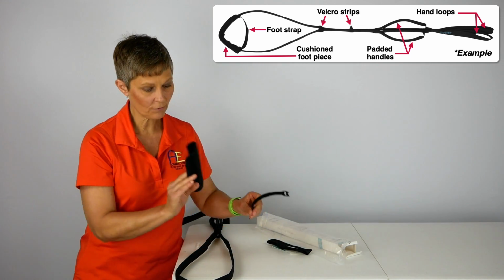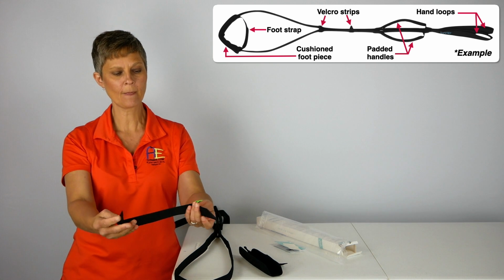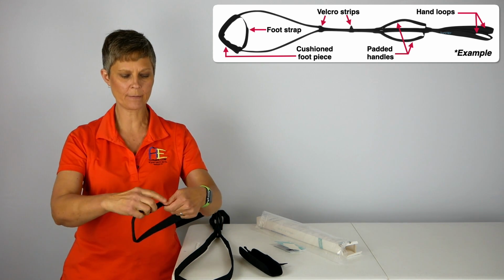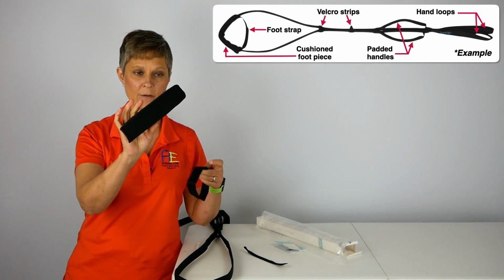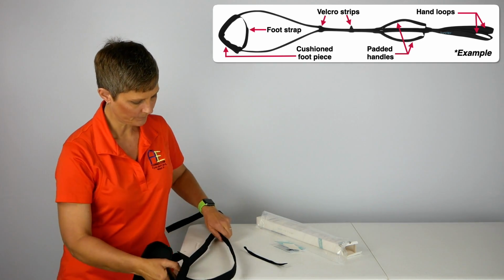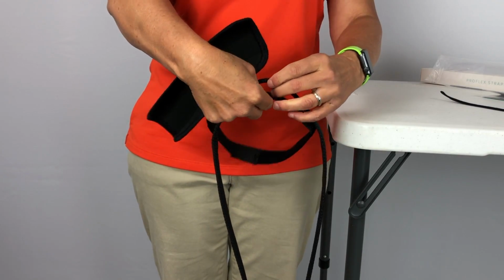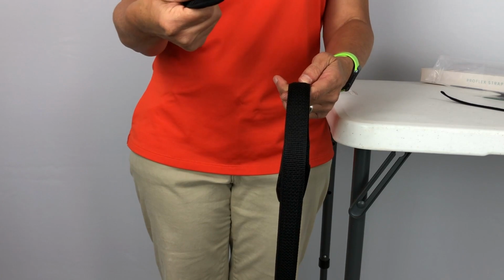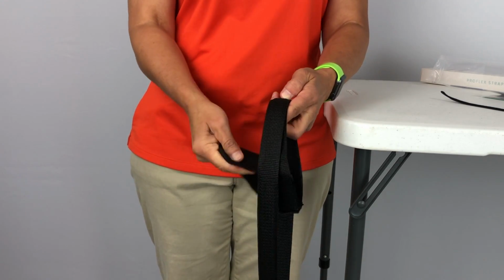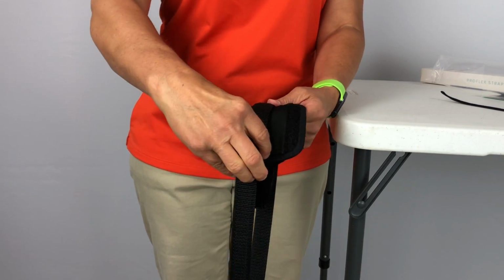So next I'm going to take the foot piece. So here's the foot loop, okay? I'm going to actually keep it together, but I'm going to widen it just a little bit like this. All right, and then we're going to take the cushioned part. So down here is where the foot piece is going to go. So what I'm going to do is I'm going to take the foot strap and place it right in here, okay? And then I'm going to take the cushion and put it right in here as well, right along the inside of this. I'm going to line it up.